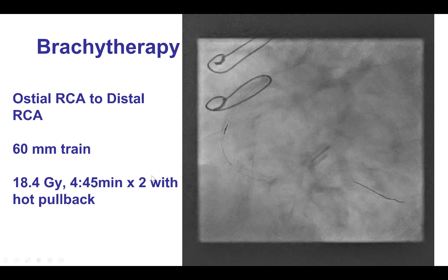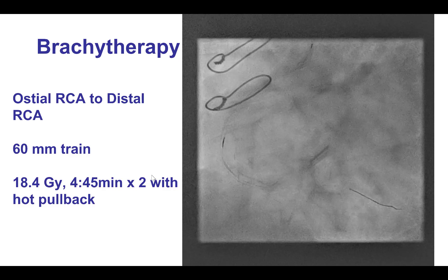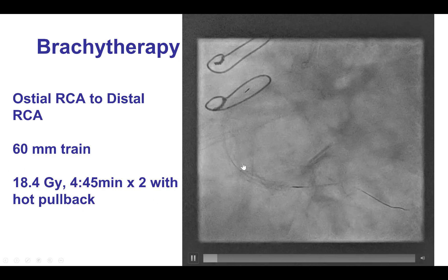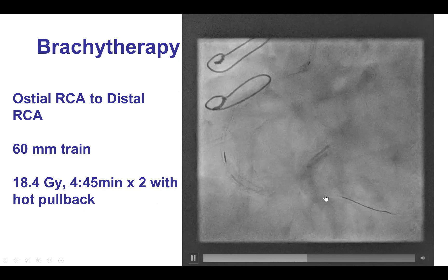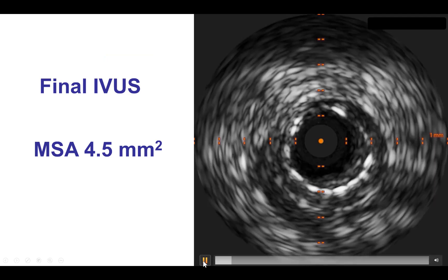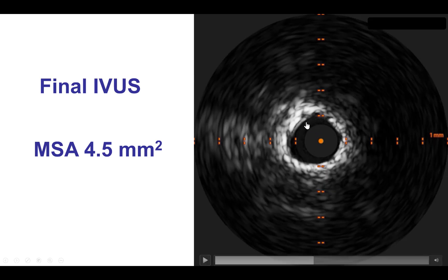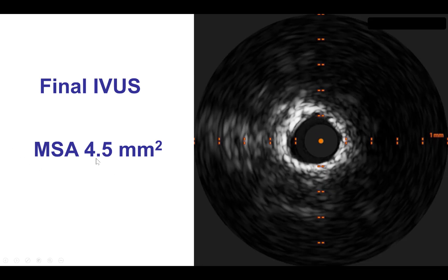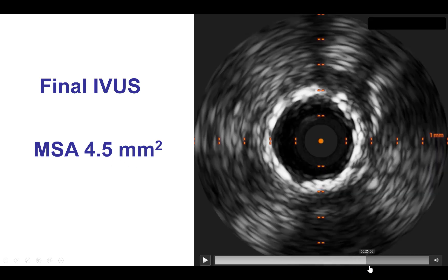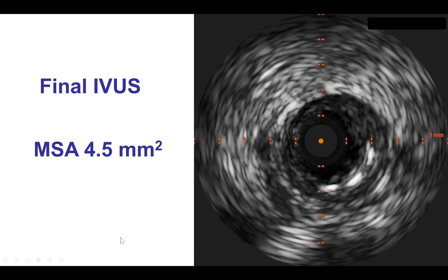We decided to perform brachytherapy anyway, which is why the patient was referred to us in the first place. This was done with a 60 mm train all the way from the distal RCA to the ostium. The final intravascular ultrasound still showed that area of under expansion — minimum area was 4.5 mm², similar to the 4.3 mm² at the beginning of the case, although the vessel proximally and distally was much better expanded.